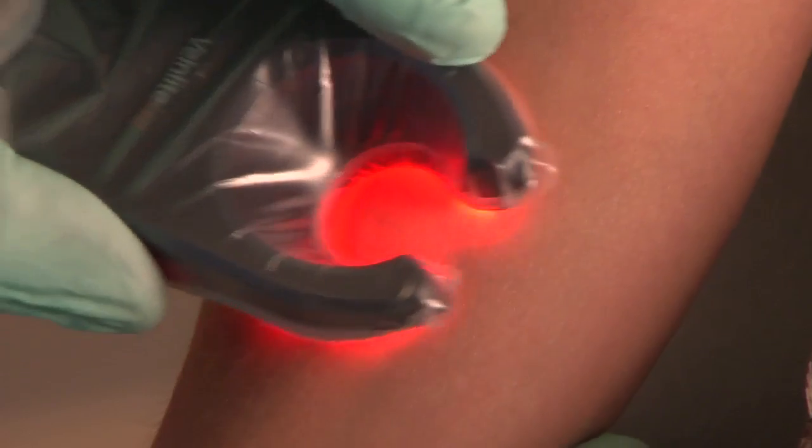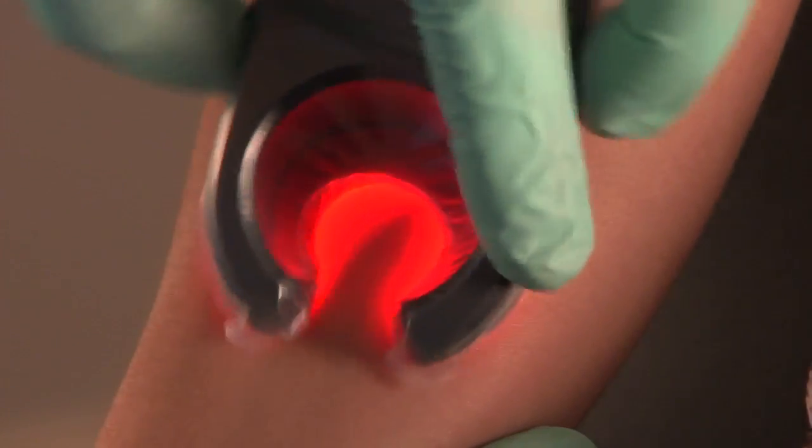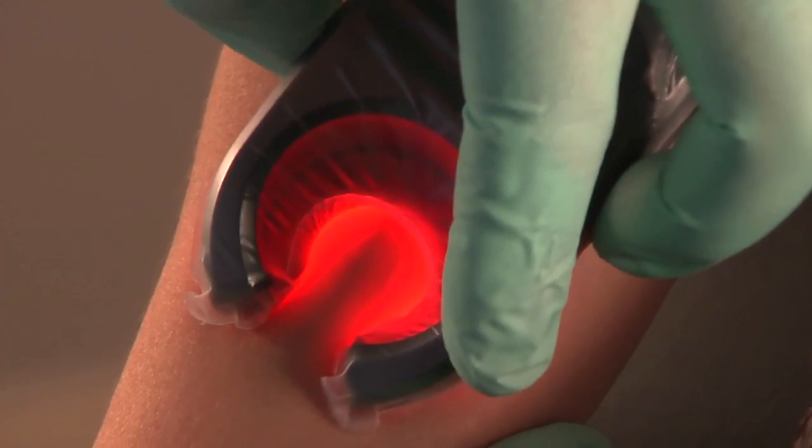Once you find a vein that is accessible, scan up and down the vein to map it and identify a good, straight access point.